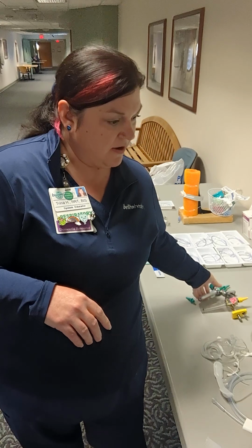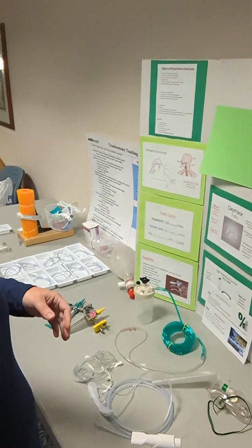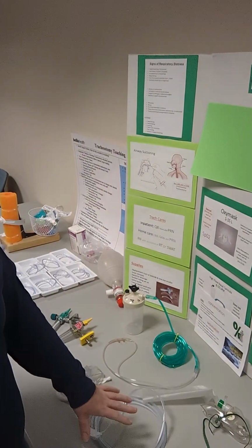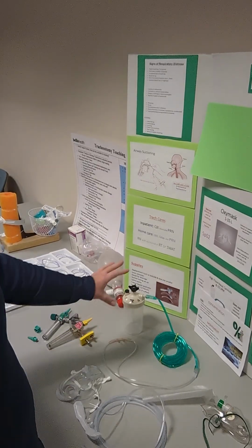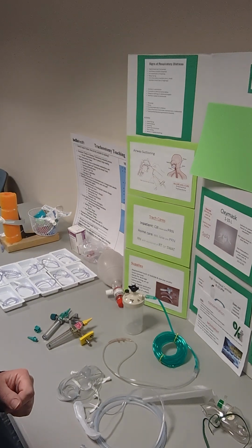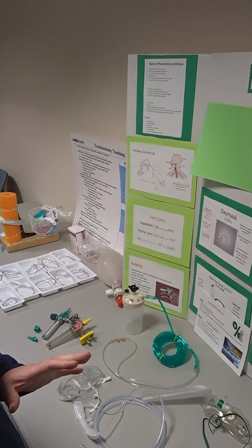And I guess that's a great time to explain that using oxygen is not going to change the way a person is breathing. It is merely going to increase the oxygen saturation. And so when we are utilizing devices here, so we have our non-rebreather, we have an oxymask, we have high flow oxygen via nasal cannula. All of those will help with hypoxia, our hypoxic patients with low saturations, but those are not going to do anything for the way in which they're breathing.